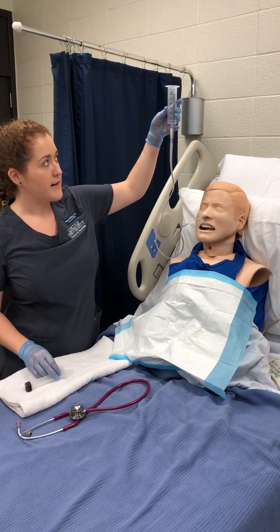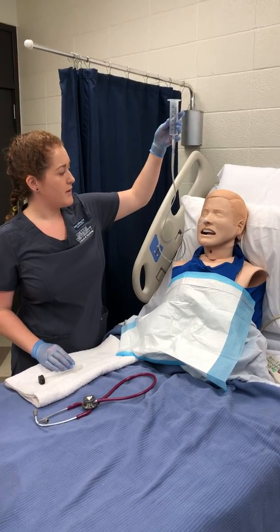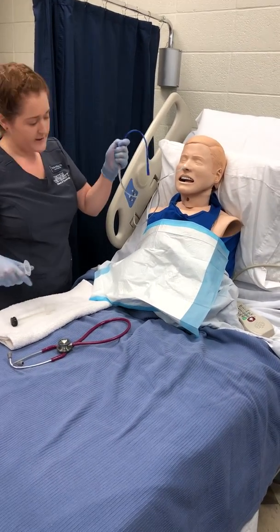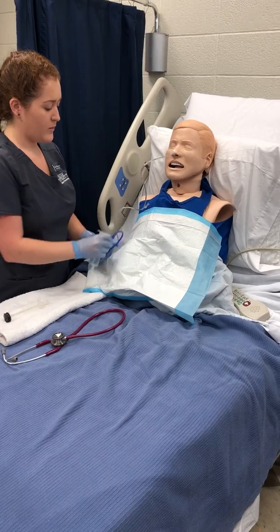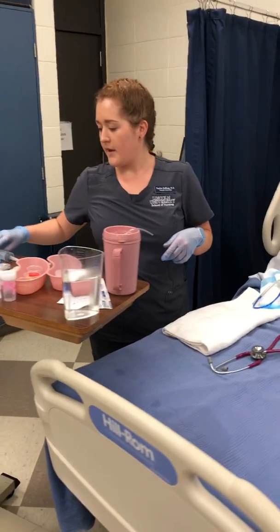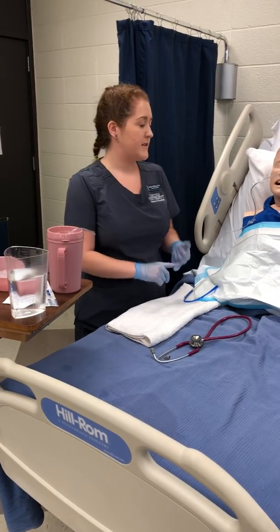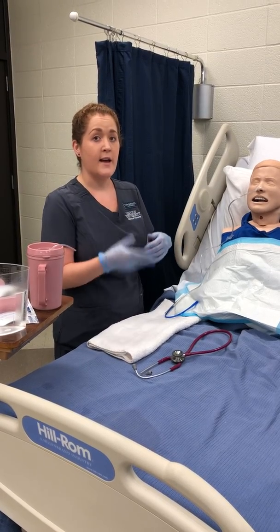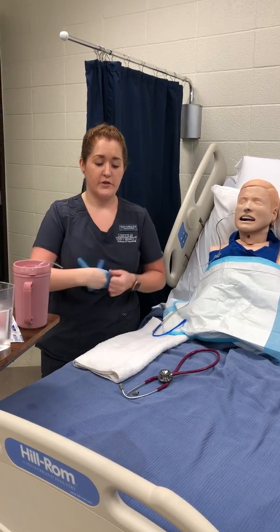So far Fred is tolerating this well — he's not in any distress, he's doing pretty well. Now that that's all gone through, I'm going to remove the syringe and clamp it again, making sure that it's still positioned in a way that is comfortable for the patient. Now I am going to document the time of the medication, how it was administered, and the amount of fluid that I administered with the medication for intake and output assessment. After all of that, now I'm going to show you how to remove the NG tube.